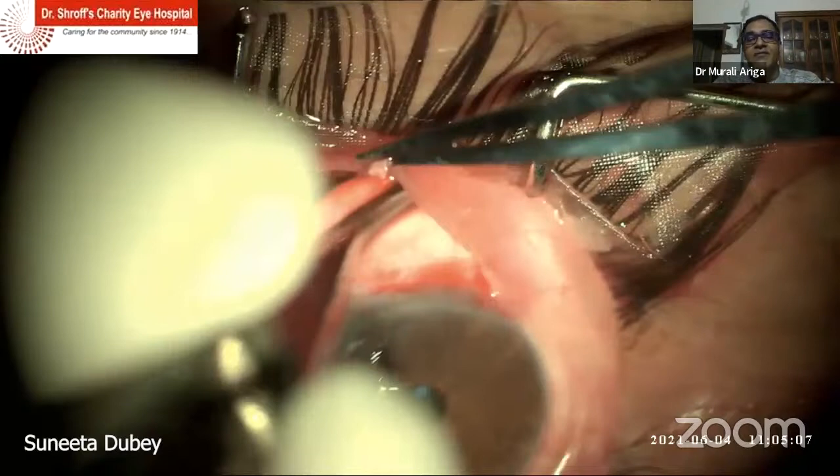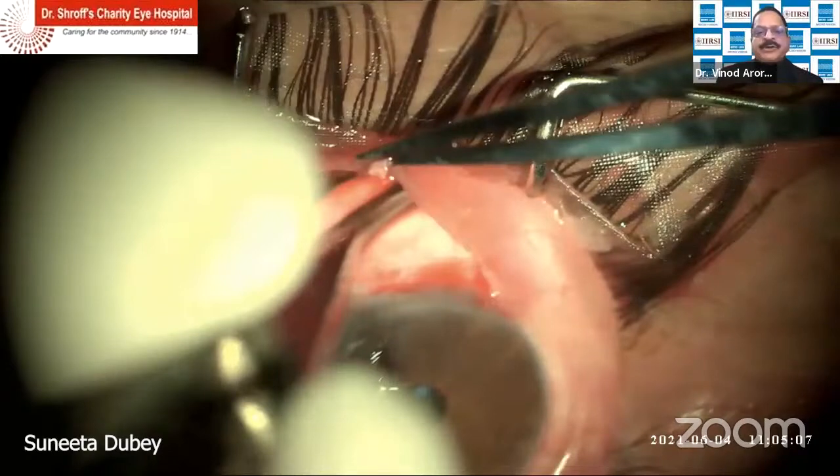And then after you remove the mitomycin, discard it carefully and give it a thorough wash with one or even two full syringes of BSS. Flush it out well and make sure the mitomycin is discarded safely. It's a toxic drug, and the drug toxicity has to be kept in mind. It should not be casually thrown away somewhere. I think this is very important, yeah.